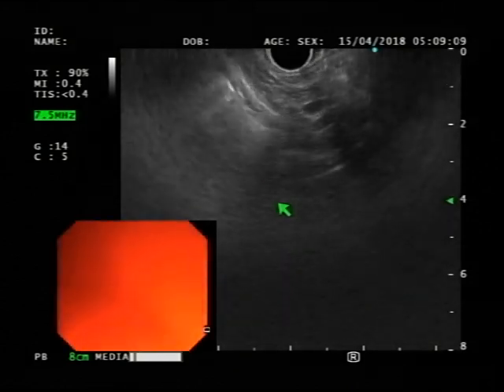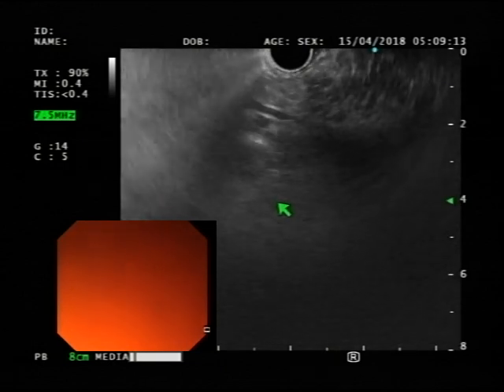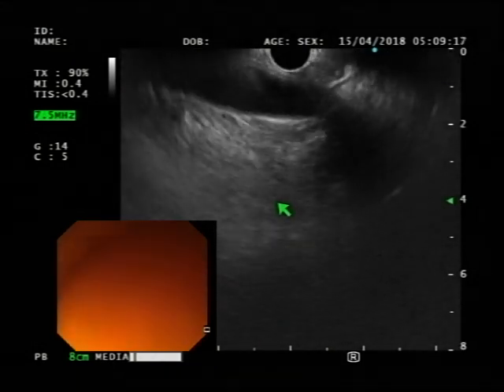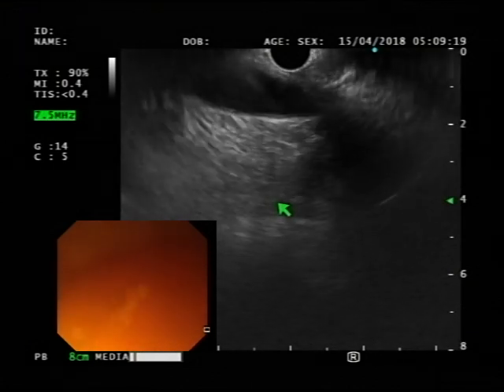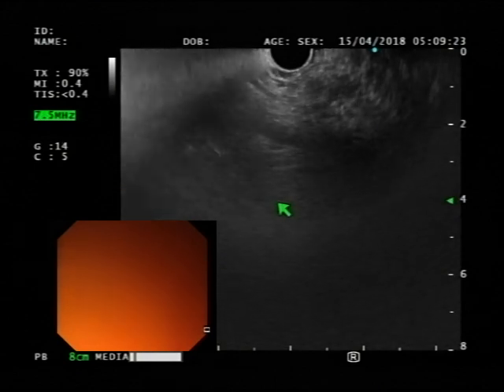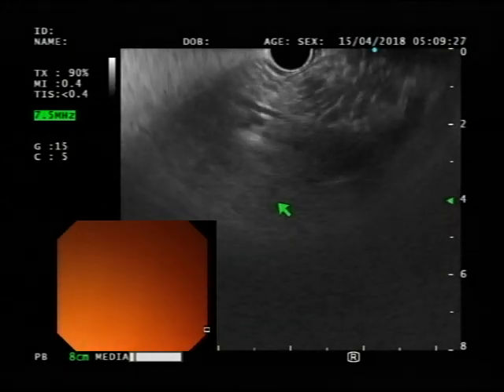How is the image quality for you right now? And as I pull back, this is straight. I tend to drop my left hand down, that stabilizes you further. There's the aorta. Yeah, it's a little better. Let me increase the gain. Whatever is optimal for you, yeah, okay.